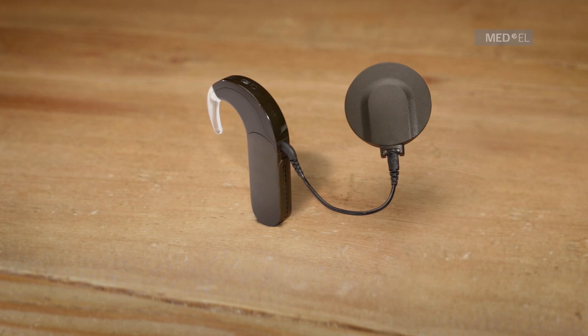Change the batteries. If no indicator lights appear after placing the coil over the implant, replace the coil cable. If an indicator light still does not appear, contact your CI center.